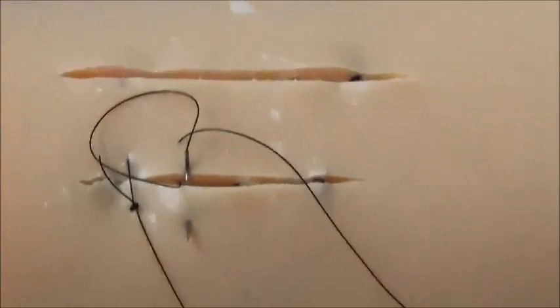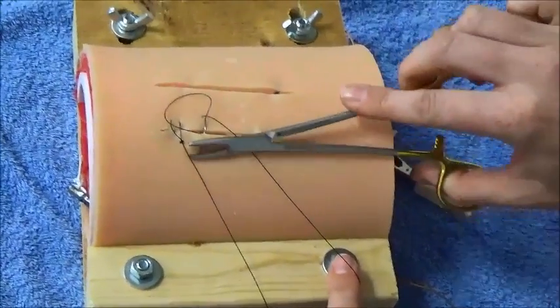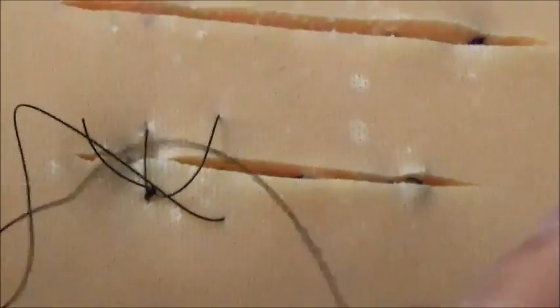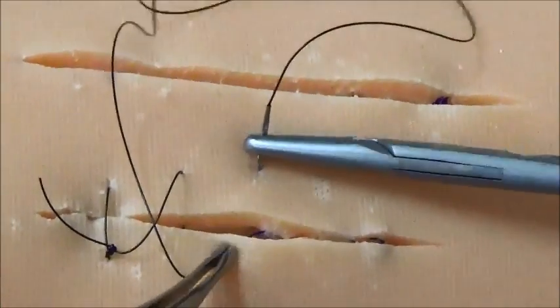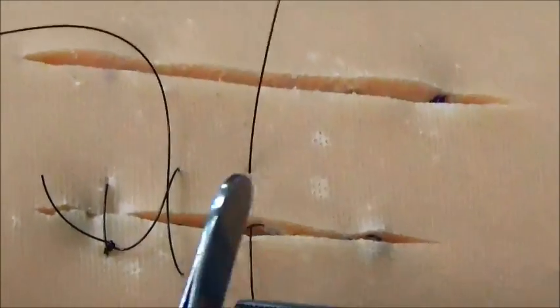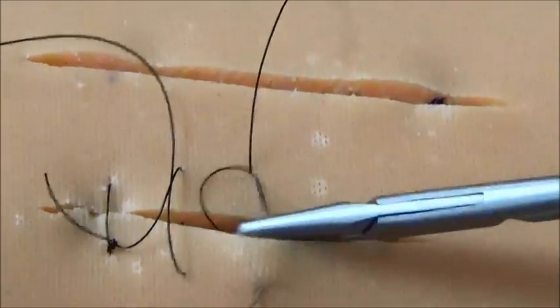And so what you'll see is that the loop created as I've come and take my next stitch, I'm going to draw the needle up in the middle of that loop. And when I do that, it creates a little square. When I take my next bite, I'm going to create the next square. So again, I'm going to come 8 to 10 millimeters down, pass my needle through, and make sure that it comes up through the loop that's created by my previous stitch.